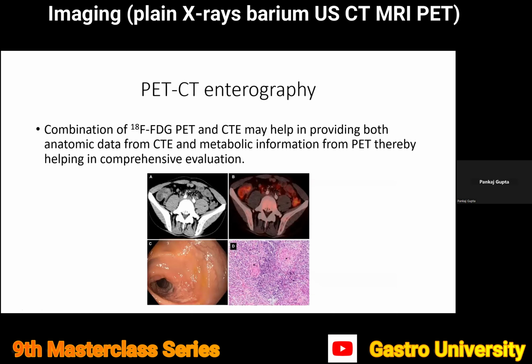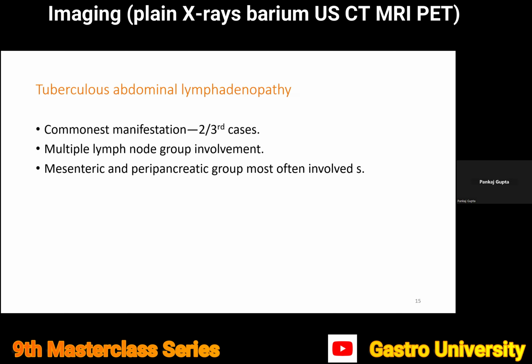We theoretically can understand that PET will add the functional component to the CT enterography component. So there is something known as PET CT enterography. However, we also understand that it increases the cost significantly as well as radiation dose. So it's not very commonly employed and is mostly used as a research tool or in various research protocols. In some cases where there is a diagnostic dilemma which remains unresolved after extensive evaluation, PET CT enterography may be utilized. Coming to the description of imaging findings in each particular type of abdominal TB.